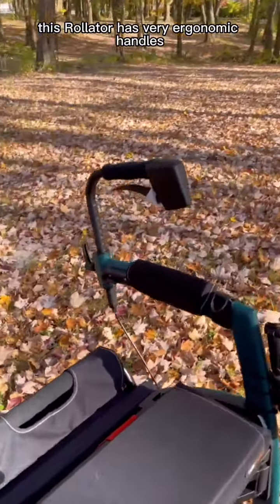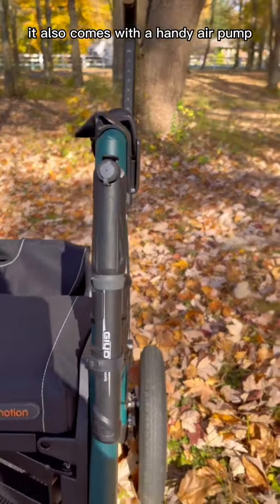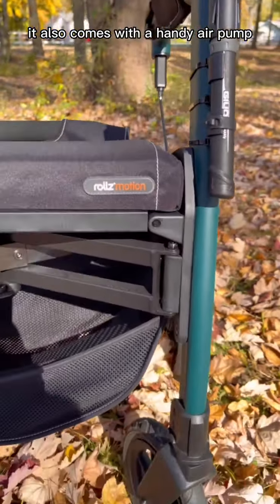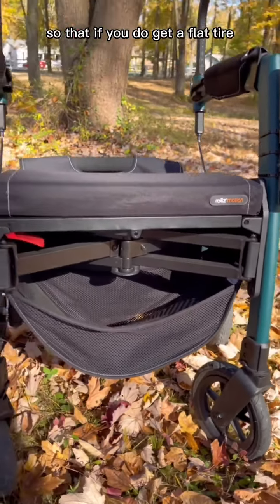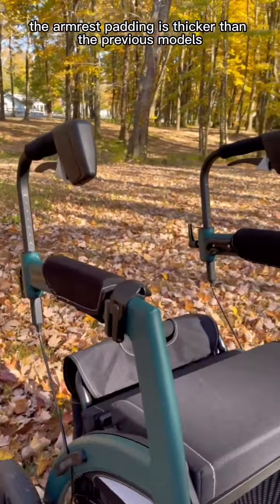This rollator has very ergonomic handles — they're cushioned very well and the brakes are very sturdy. It also comes with a handy air pump so that if you do get a flat tire, you can fix it on the go.